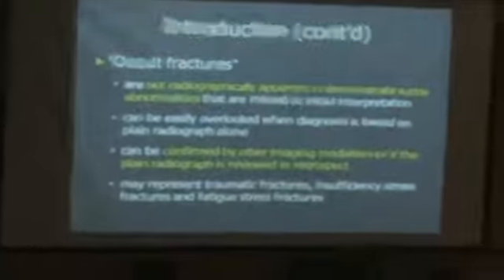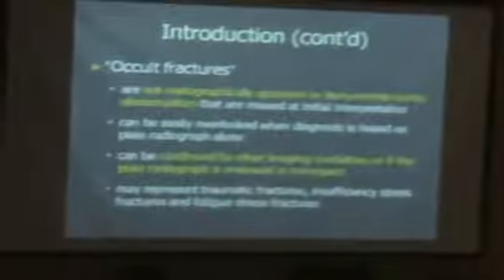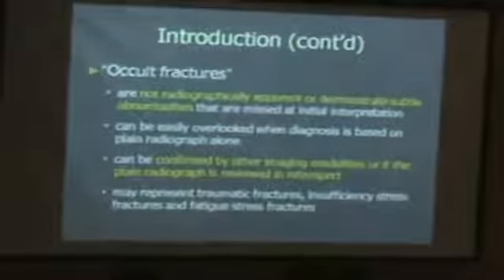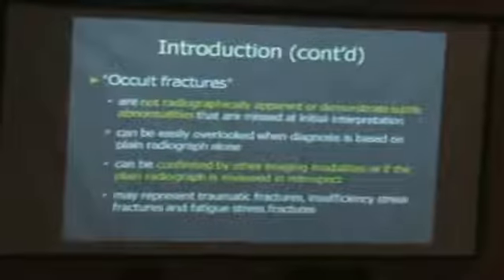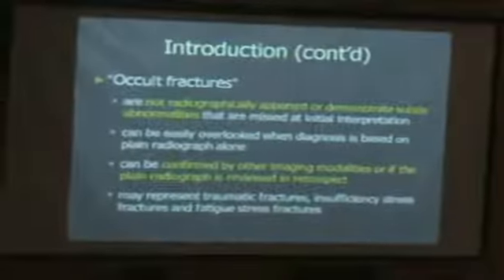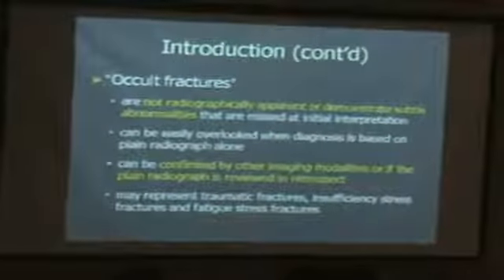So the residents in my hospital, they always do the same thing. You have a patient coming with pain. What they're going to say is there is no radiographic fracture, but if clinically indicated and the patient is really of high suspicion of fracture, a CT scan or MRI may be indicated. So that's actually the whole thing, because they put it there, it's much more legal than anything, so they don't want to get into a lawsuit.